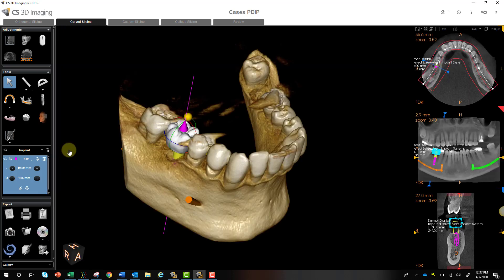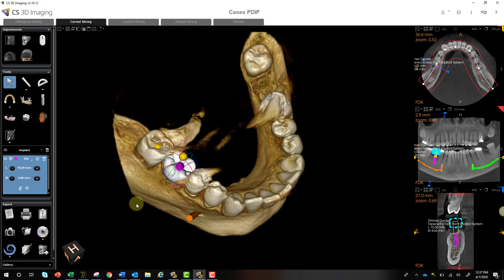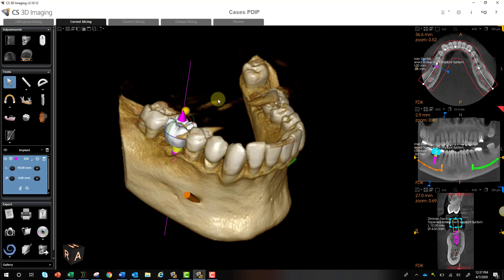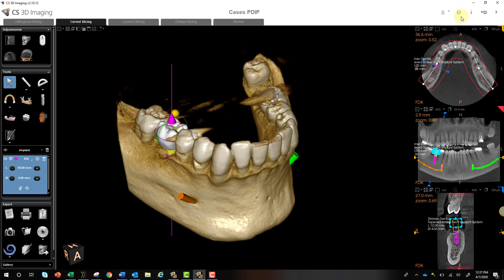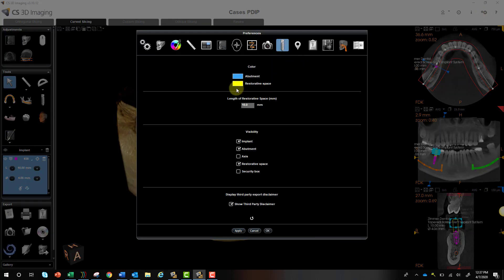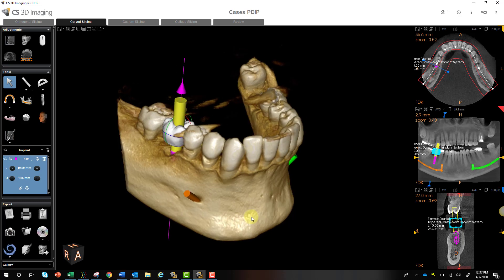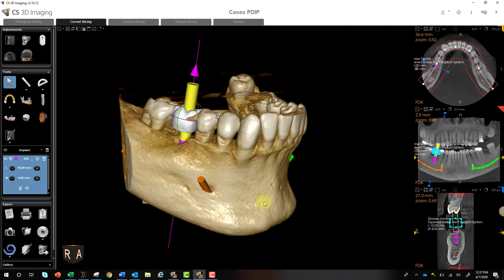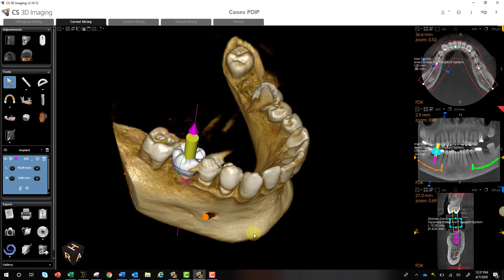Now we can see a couple of things: where the implant is protruding out, and the yellow restorative space. For a better visualization, go into your Preferences, go to Implant, and change your yellow restorative space to 20 millimeters. Now you can much more easily see how that implant is planned and where it's going to project out for restorative purposes.